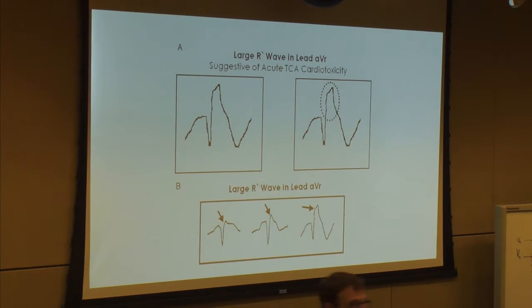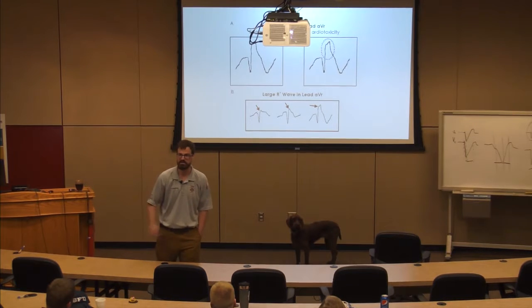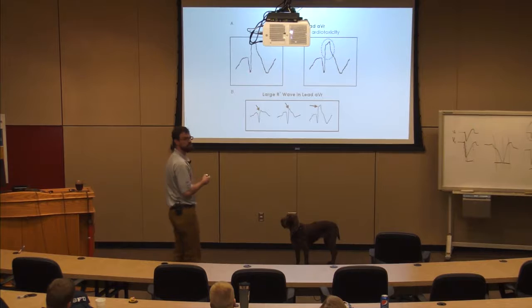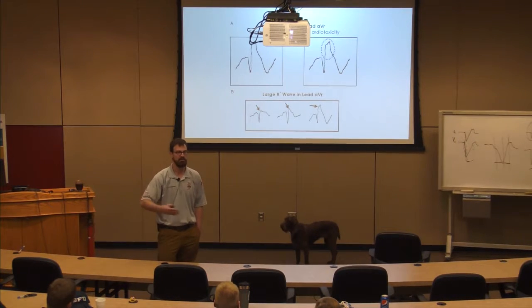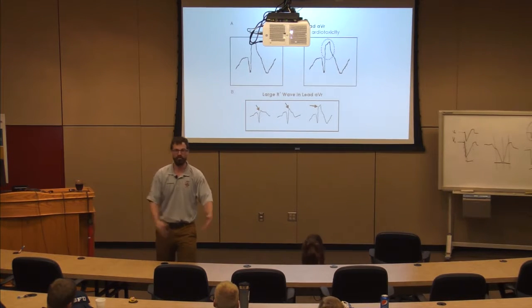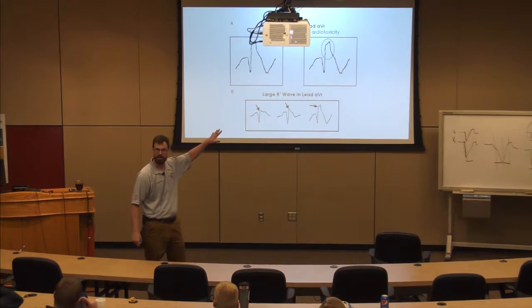Can somebody have an R wave in AVR? Sure, they can have an isolated R wave in AVR, but in the right clinical setting, remember, we talk about EKGs here like we're treating an EKG. In the right clinical setting, here's what I'm looking for. If you come in with chest pain and shortness of breath, what am I looking for when I get a 12-lead EKG? I'm looking at ST segments, and I'm looking for reciprocal changes. If I show up on scene and you've got 4 bottles of pills and a love note to your ex-boyfriend, what am I doing an EKG for? I'm looking for interval abnormalities, right?